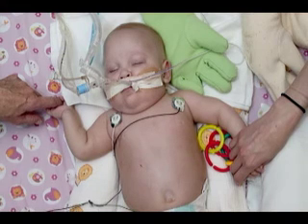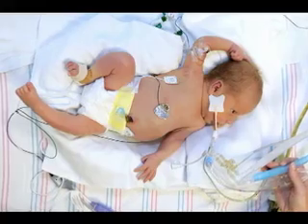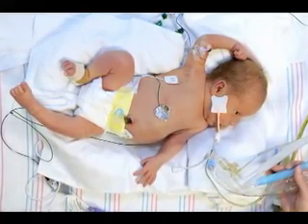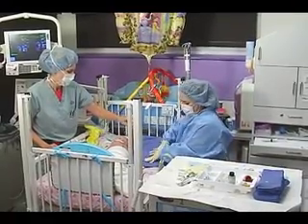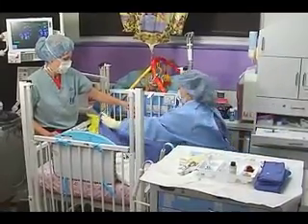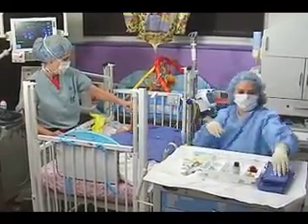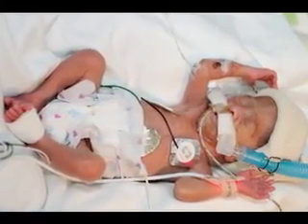Neonatal patients often require long-term vascular access for the delivery of life-sustaining medications and nutrition. Peripherally inserted central catheters in neonates, or neonatal PICCs, offer several advantages over other central vascular access devices. Neonatal PICCs can be inserted at the patient's bedside with the use of an analgesic agent and radiographic verification and remain in place for several weeks or months. The small diameter of its lumen is ideal for the extremely small neonate.